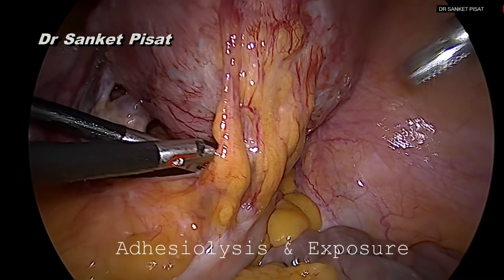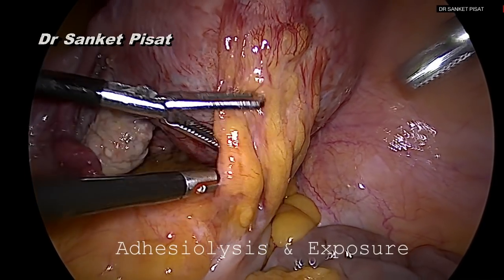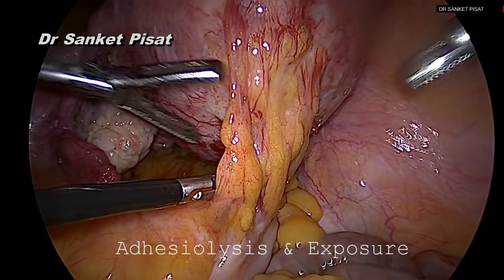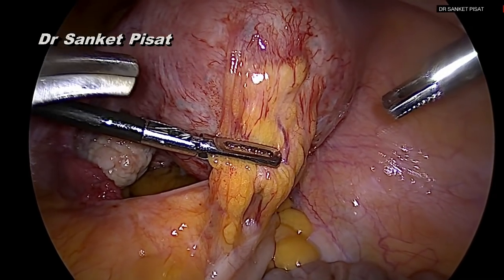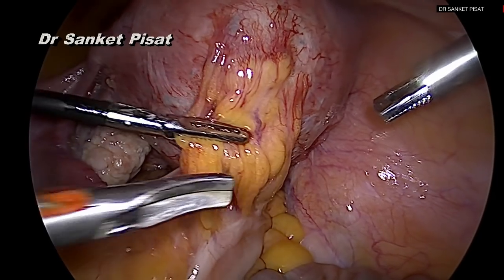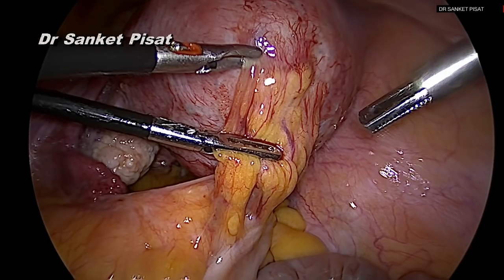The first step to performing this is adhesiolysis and adequate exposure. As in the case of this patient who has some endometriosis and bowel adhesions posteriorly, first the bowel adhesions to the posterior surface of the uterus are released using a bipolar sealer and cutter.